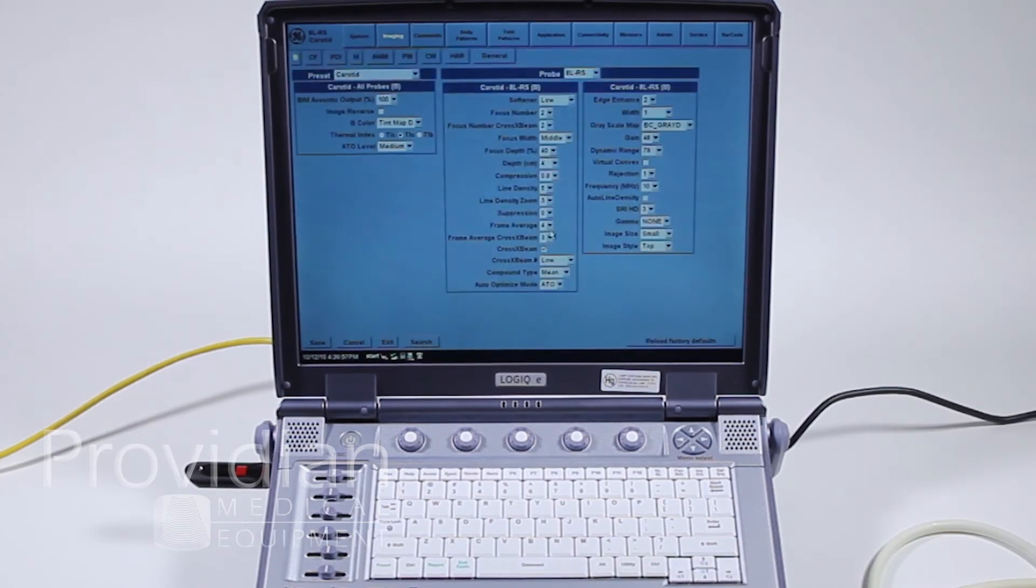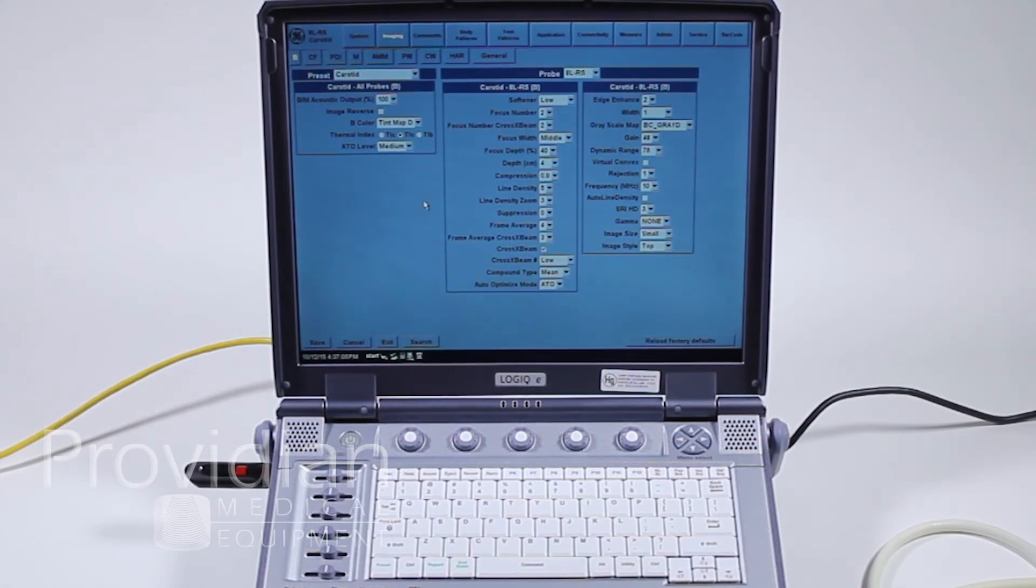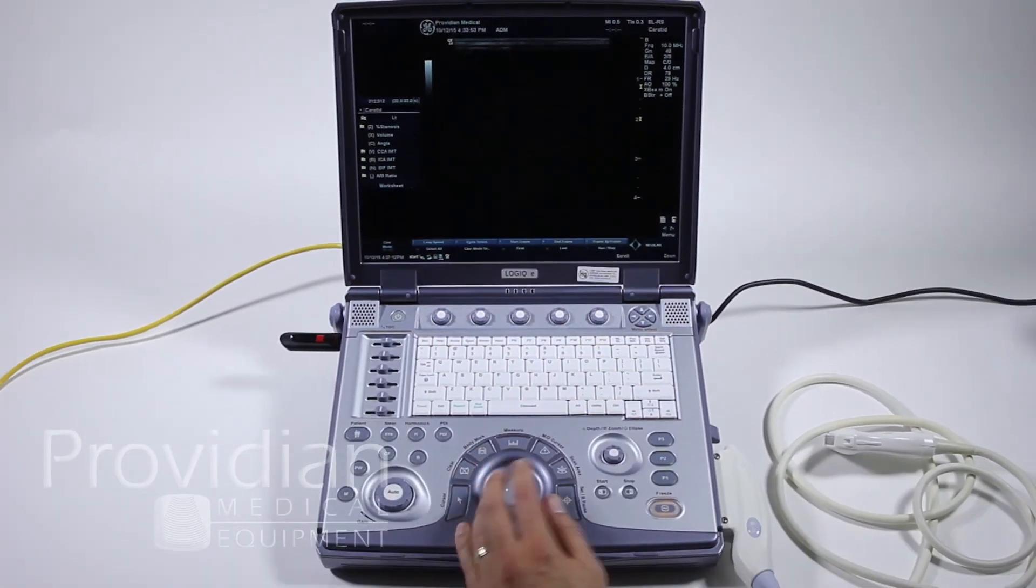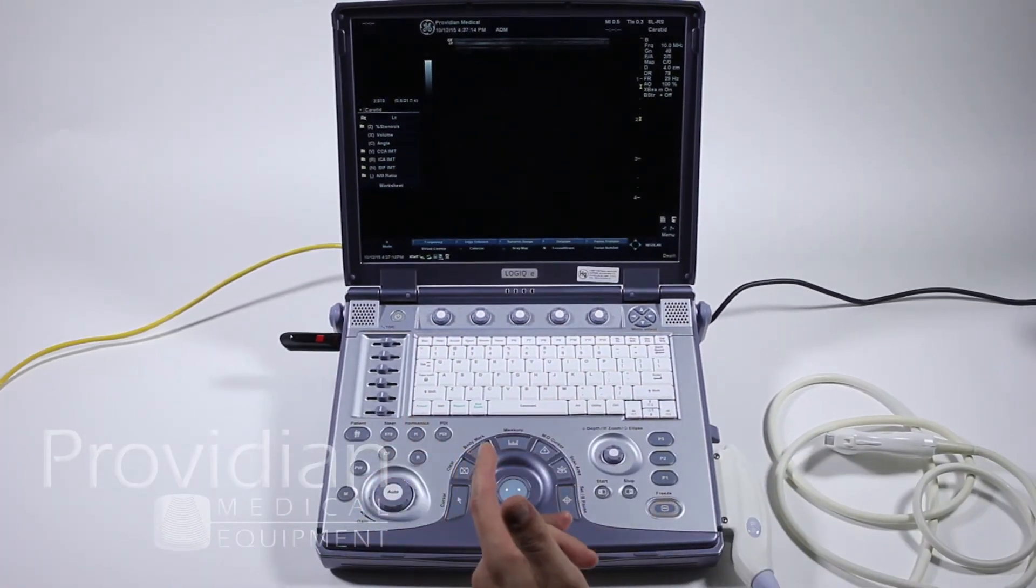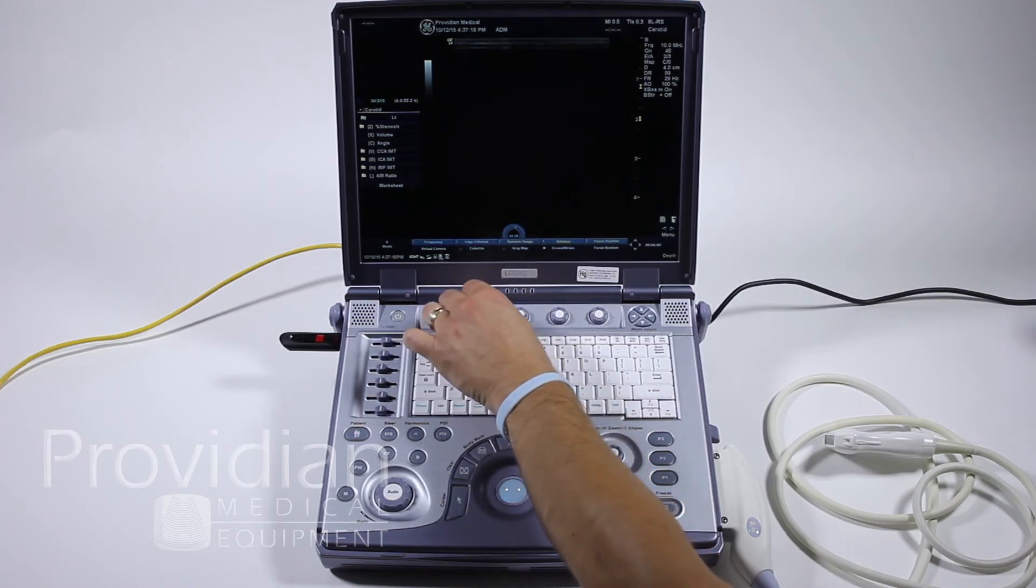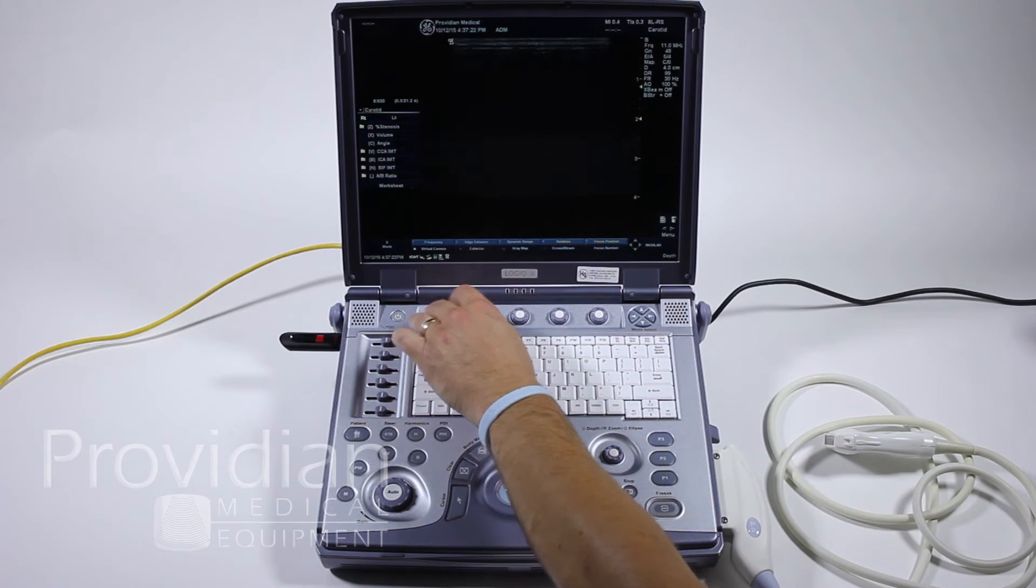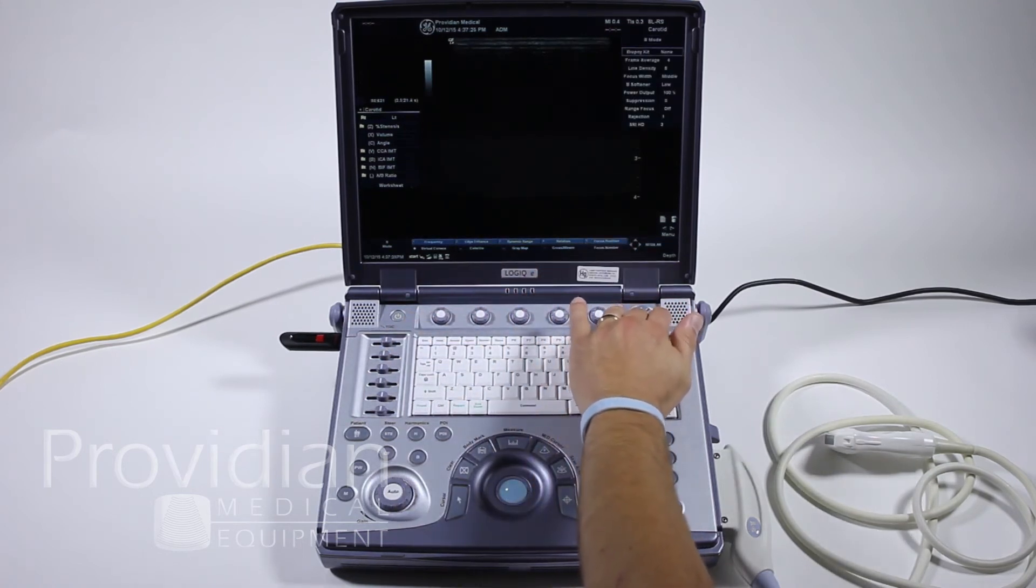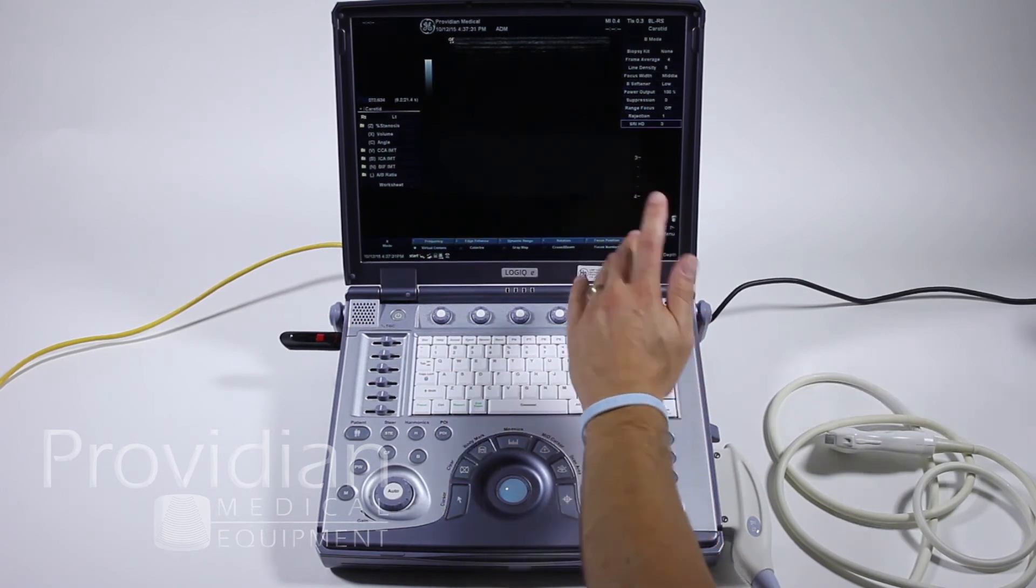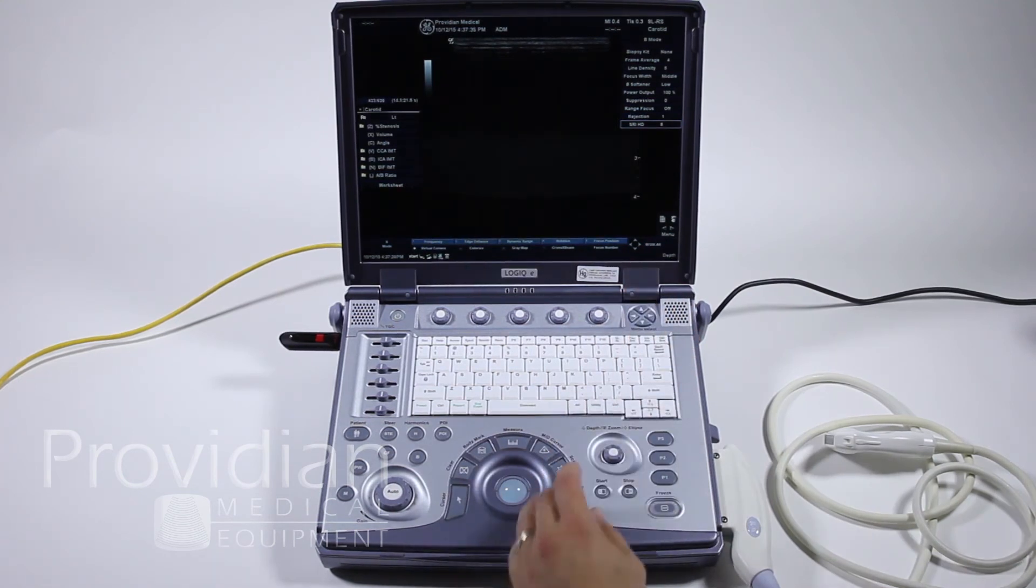I'm not going to save the changes. I'm just going to go over to imaging. And here you can really get into the nitty gritty of customizing your presets. So instead of going through all these, let me show you a different way to customize presets. Let's say just in regular B mode, we make some changes to the dynamic range, edge enhancement, the frequency, turn on virtual convex. And then we might have changed some parameters as a line density, frame average, or some of these things all the way down here. Change our speckle reduction imaging mode, for example, to a higher end of speckle reduction.